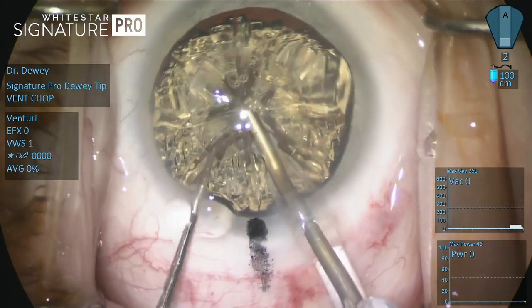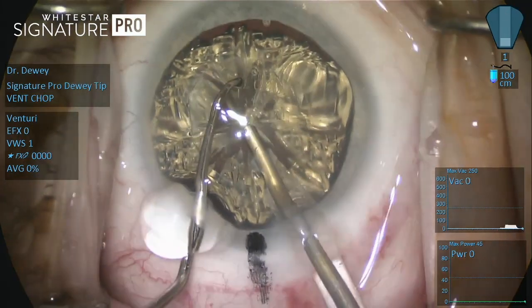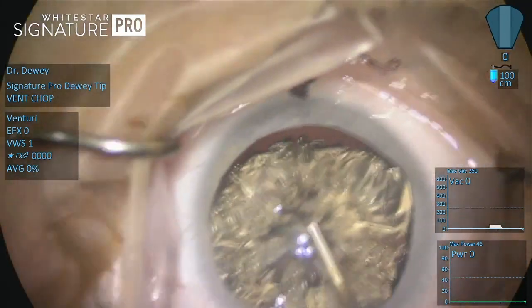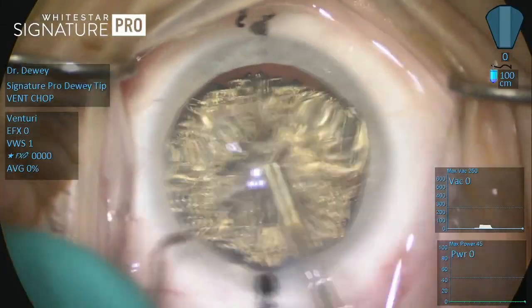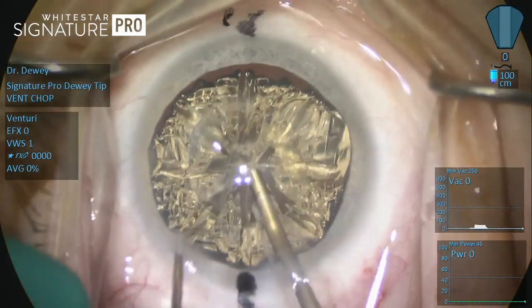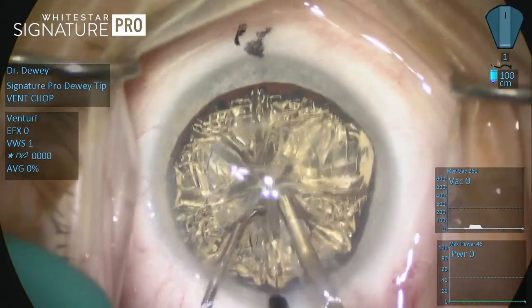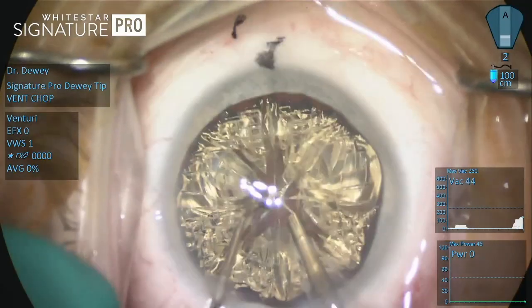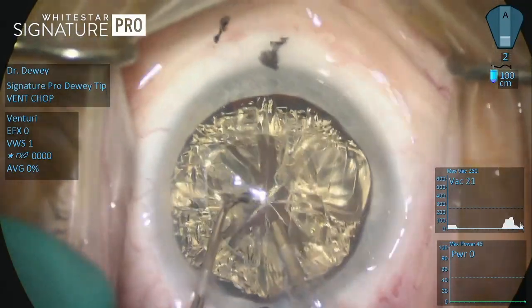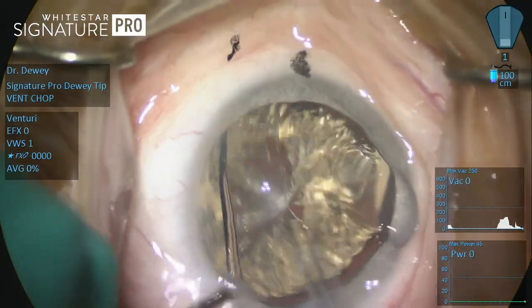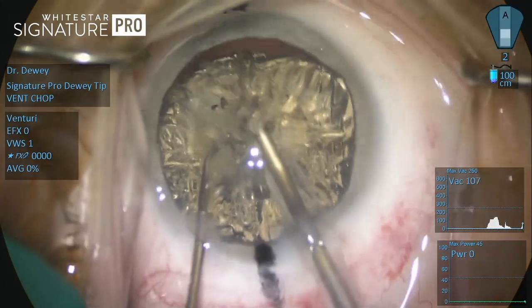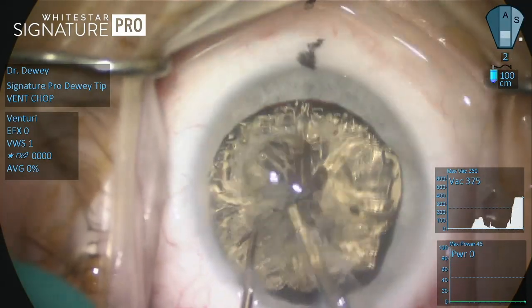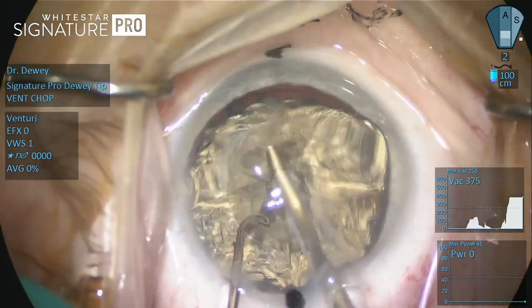In the beginning of the case, when the nucleus is still intact, the tip of the phaco needle is brought into approximation with the surface of the cataract. Flow has very little effect in this stage of the case, except to draw in stray particles as power is applied. As the tip is occluded, either with peristaltic or venturi vacuum, the system applies force to the preset maxima as the foot pedal is depressed.